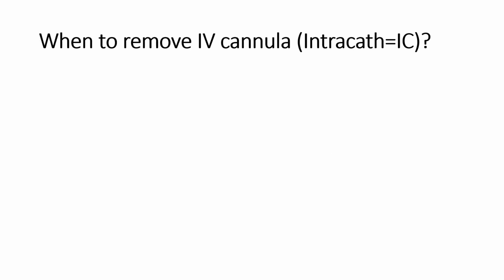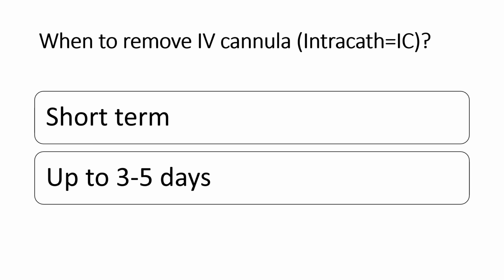Now, when to remove the IV cannula? It is used for short term only. So ideally we should remove it within 3 days. Maximum we can keep it up to 5 days.